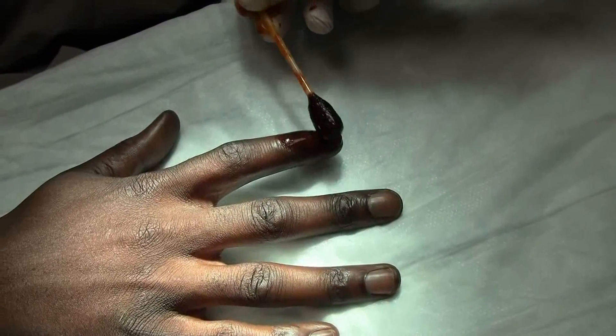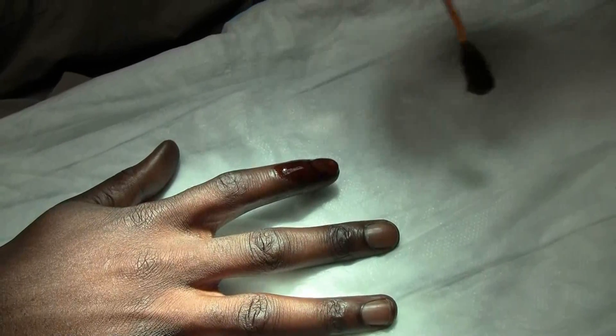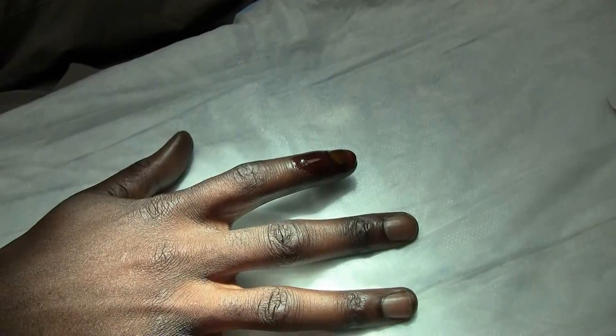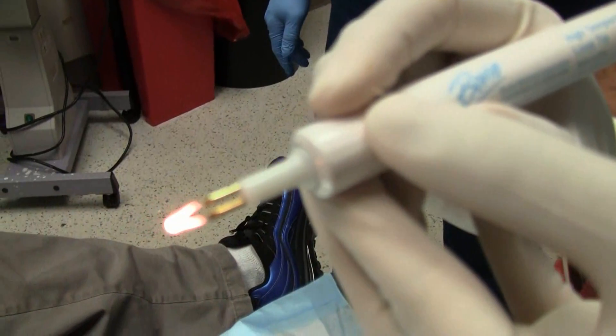Dr. Adrian Amin is going to be doing a procedure here. Dr. Amin, you want to tell us what you'll be doing? So we're going to be draining a subungual hematoma here on the second digit on the gentleman's right hand. And we're going to be using the Bodhi to do that today.